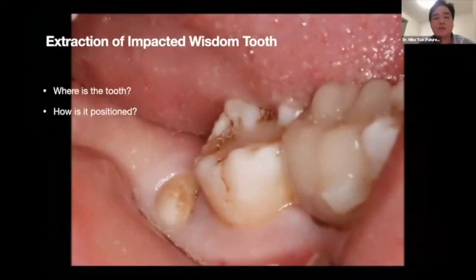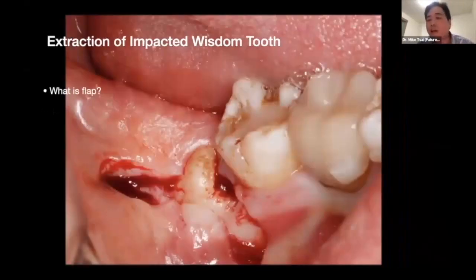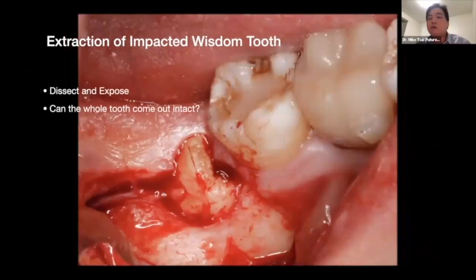So where's the tooth? Obviously, we see there's a little yellow spot there. That's part of the tooth, and that gives you a clue. And so we make a flap. You make your incision and you lift up the gum, so the gum becomes a little flappy. So that's a flap. Once you have the flap, you dissect down and expose the tooth. So that's where the tooth is. It's consistent with what we see on the x-ray, right?